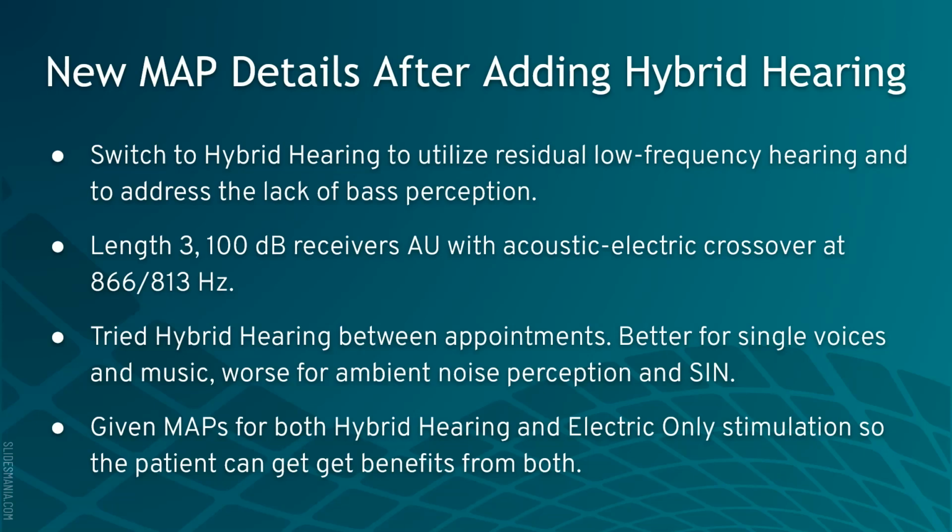The patient tried the hybrid hearing between appointments, and the notes he gave back to us on his follow-up, which was a couple days later, was that it was much better for single voices, and he got a lot more music appreciation with the hybrid components. However, he said it was worse for ambient noise and speech and noise. So I'm not necessarily surprised by that because we gave him back a lot of low frequency hearing in one shot. And, ambient noise, steady state noise tends to be low frequency. I'm sure that noise stuck out to him like crazy. He hasn't been hearing it for a long time.